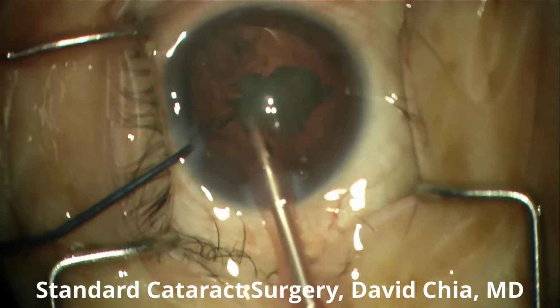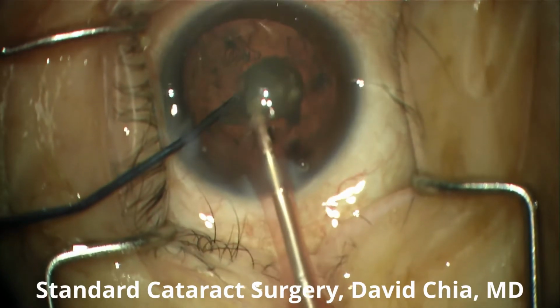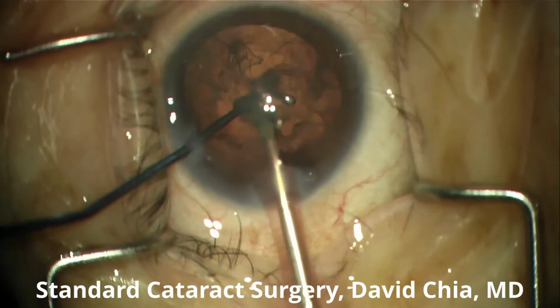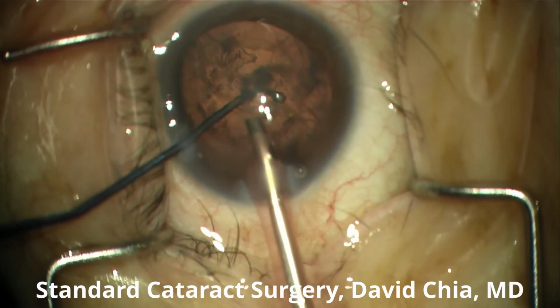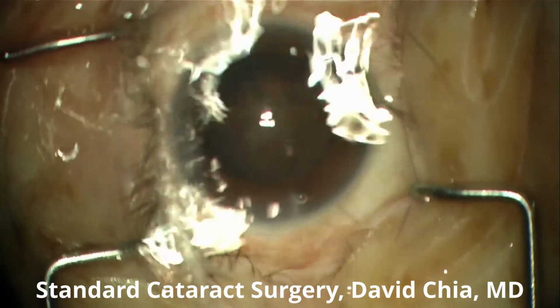We're also keeping in mind that the patient can feel some of these small movements. Even though there's anesthesia, they can still feel the small movements of these instruments, but this is generally very well tolerated and anesthesia is very effective.